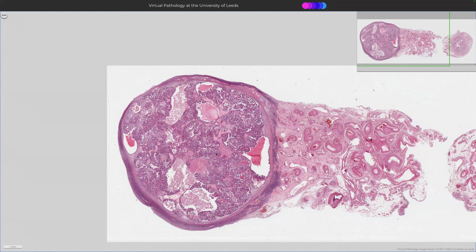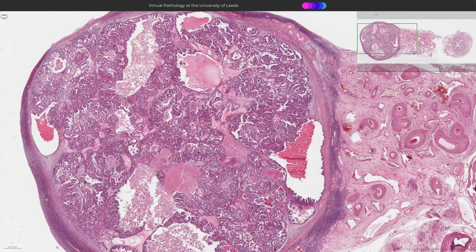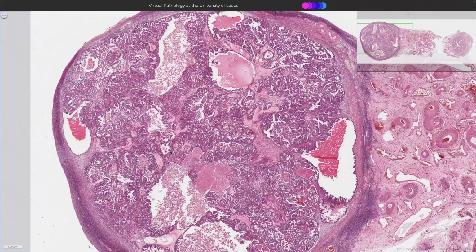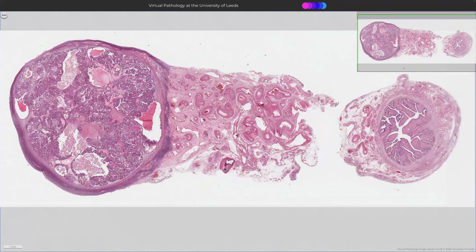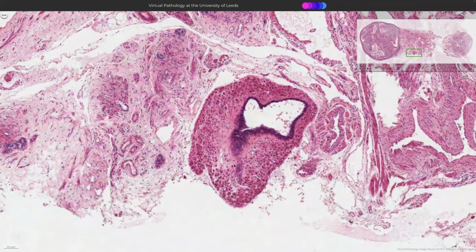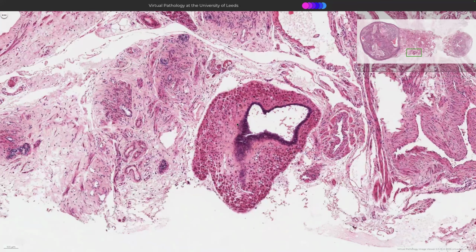Okay, so clear cell carcinoma of the ovary, characteristic appearance, some pitfalls in that it can grow in a papillary fashion and that it's not the only clear cell thing on the block. And sometimes it's not even clear cell. Let's look around. Just waiting for this to sort itself out. Okay.